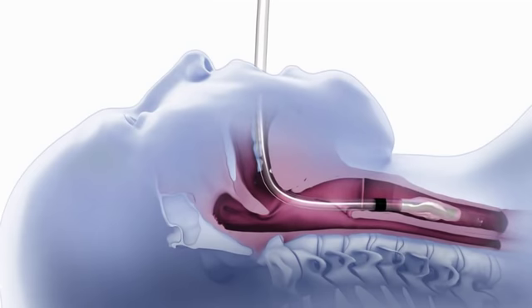Once the endotracheal tube is in place, inflate the cuff and attach a waveform capnography monitor to confirm proper tube placement.